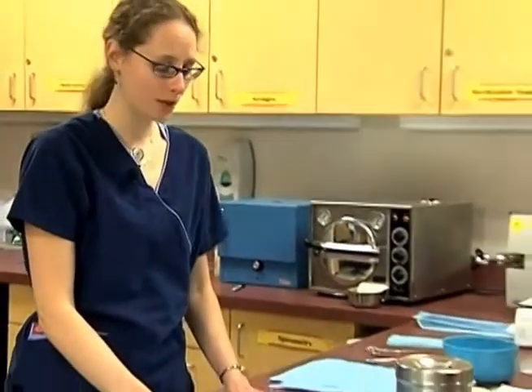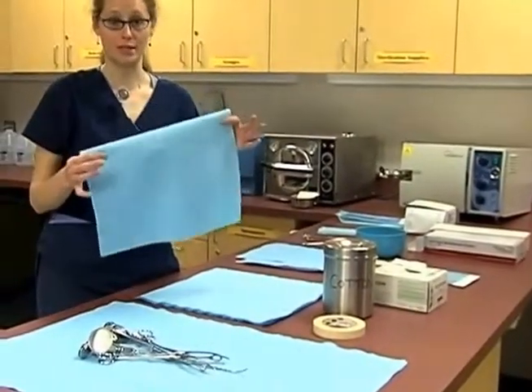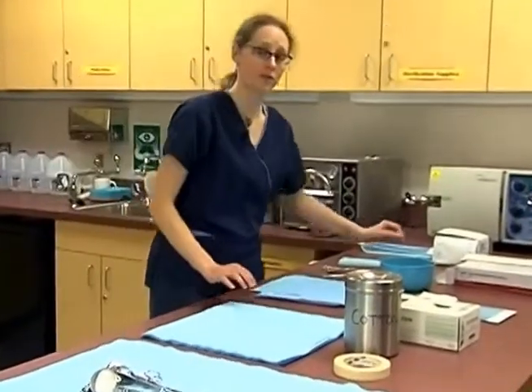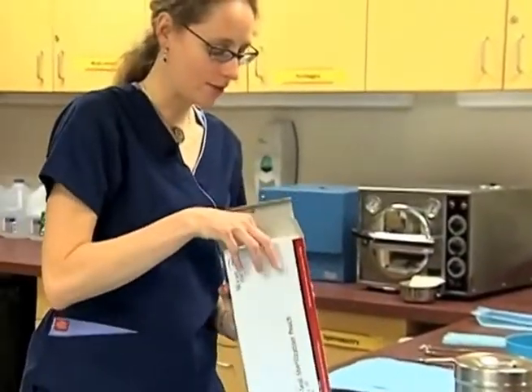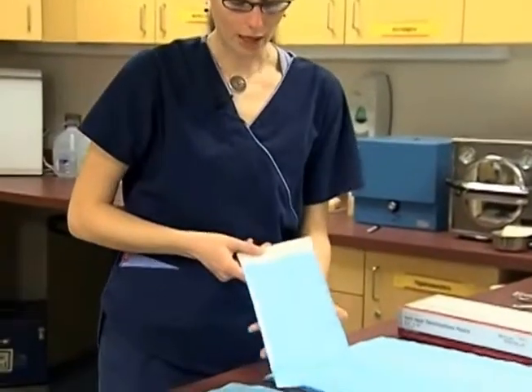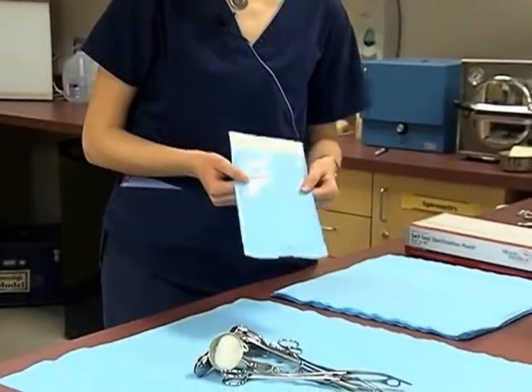Once we have our surgical tools ready, the other supplies we're going to need is autoclave paper. A lot of times it's just this blue paper — sometimes people refer to it as CSR. Other things that some offices prefer are pouches, and they come in a variety of sizes. They're very handy to use, and as you'll see later when we do wrapping, this is a lot easier option, though they are a little bit more expensive.